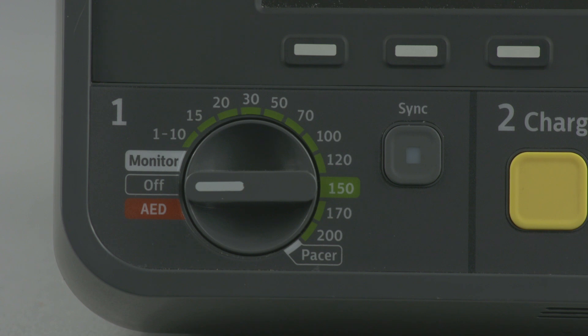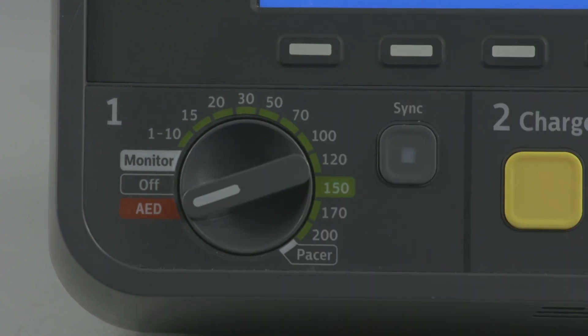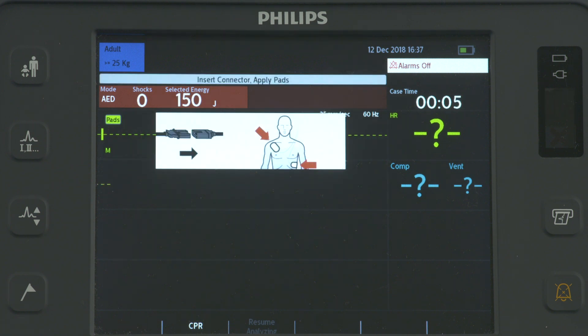To defibrillate in AED mode, you turn the therapy knob to AED, and the HeartStart Intrepid announces and displays the current patient category. The HeartStart Intrepid then checks to see if the therapy cable and multifunction electrode pads are properly connected.